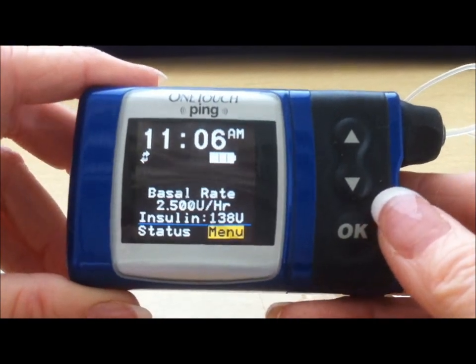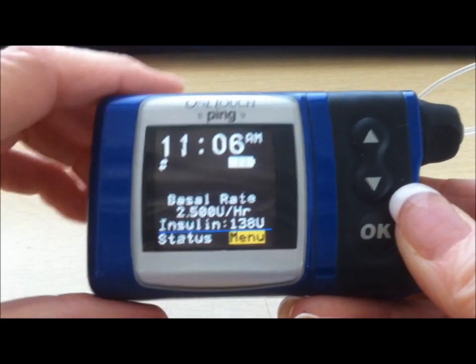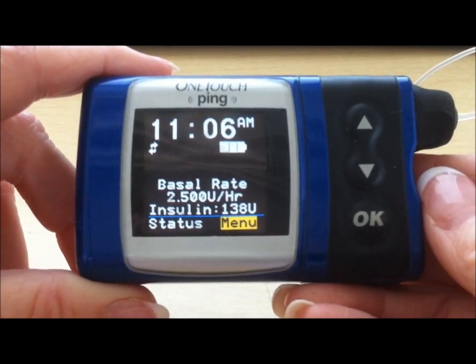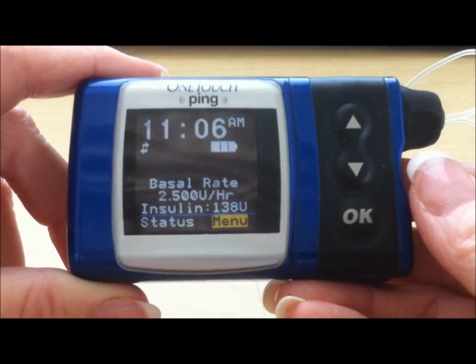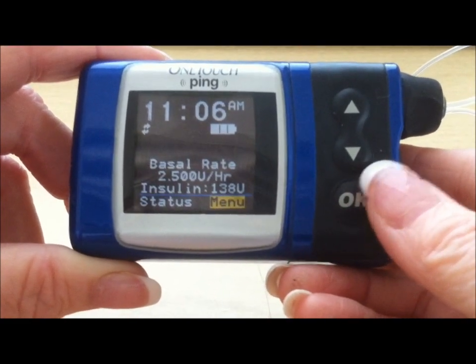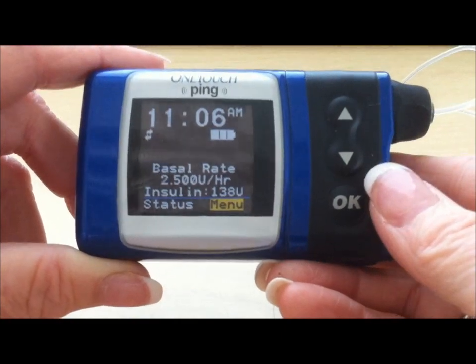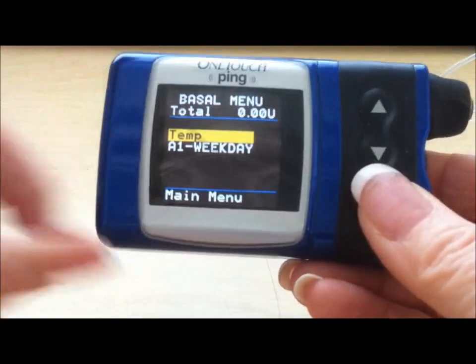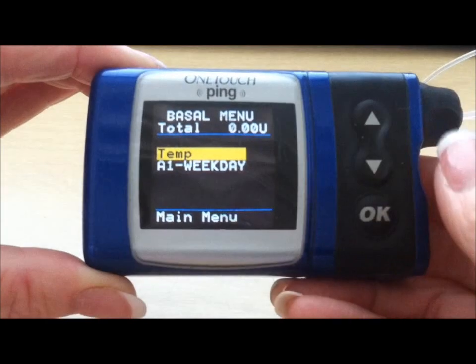It's also important to know how to set a temporary basal rate. Currently in this example the person is getting 2.5 units of insulin per hour, but certain activities may require less or more insulin. Exercise — muscle that is toned uses insulin more efficiently than muscle that is not toned — so oftentimes during exercise people need a lower basal rate. You can either disconnect the pump or put it in a temporary basal rate. The numbers for how long to use the basal rate and the percentage to decrease it are decisions that must be made by the health care provider. From your main menu, press OK, go down to your basal option.